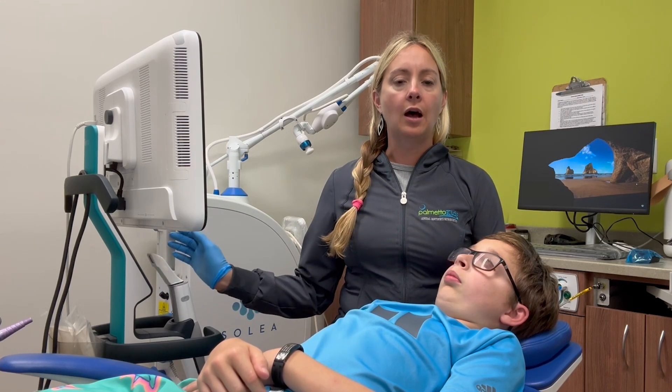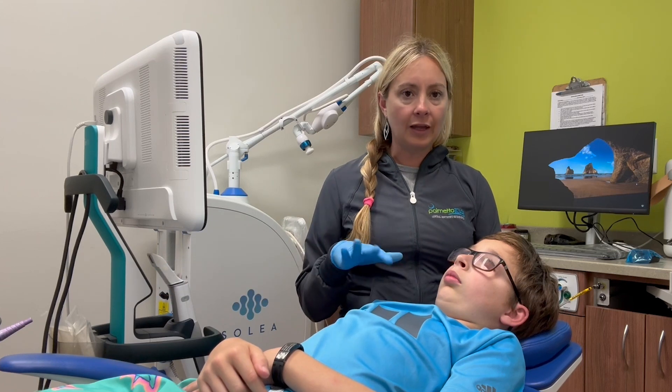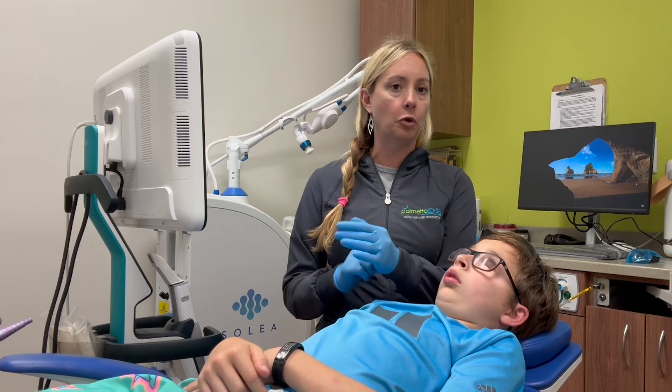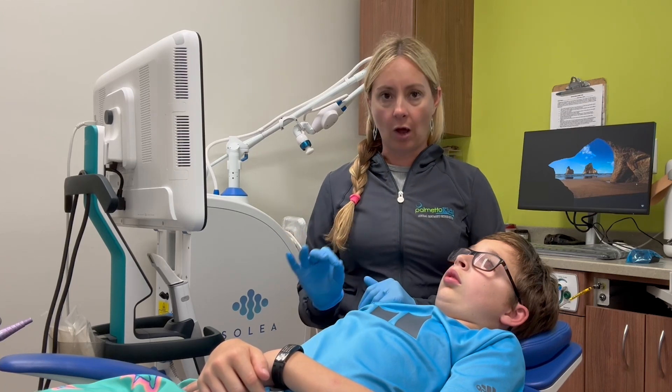We use this scanner if we need to do crowns, for braces, if somebody needs a thumb-sucking appliance — anything like that. We can pretty much use it as long as the kids can get in the chair and open their mouth, which is awesome.